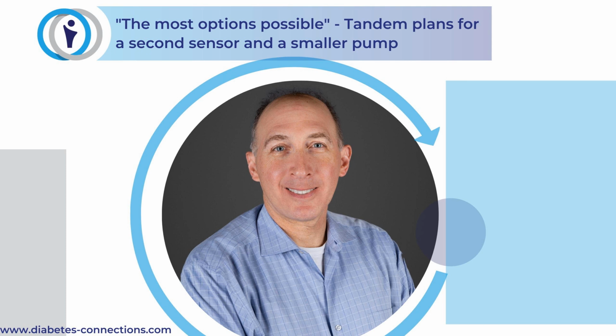And it was great to be involved in a lot of the trials that led to its development and eventually putting it on the Tandem pump, because Control IQ gives what we call auto boluses. Control IQ will give you up to 6 units at a time, up to every hour, separate from what it's doing, modifying the insulin in the background, the basal rate modulation.